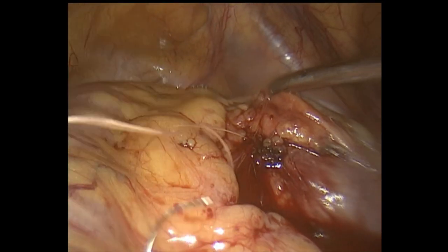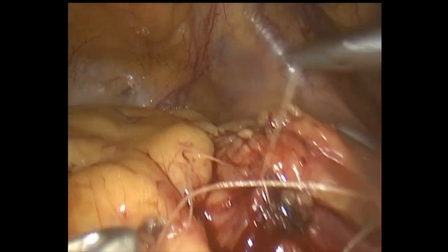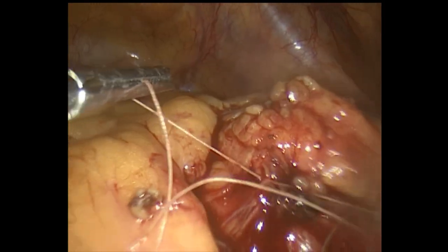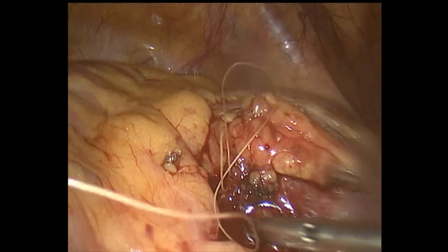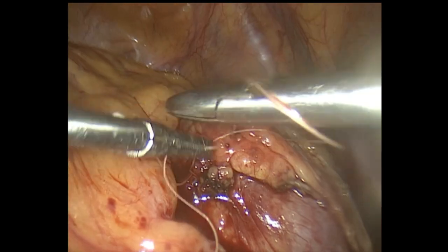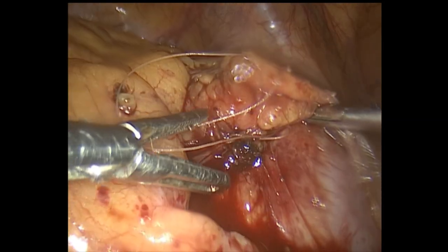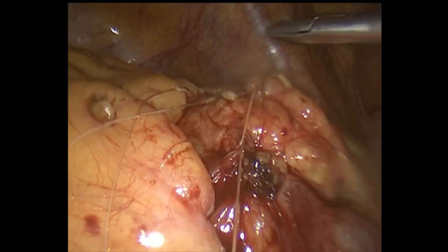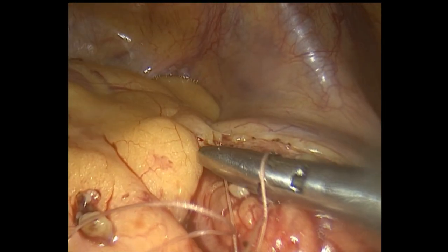You can cover this area with omentum also. But as you know, within 24 to 48 hours, the omentum is going to seal this area. So you can leave it as is. You can see that a full, watertight closure is being done for the nephrostomy or pyelostomy.